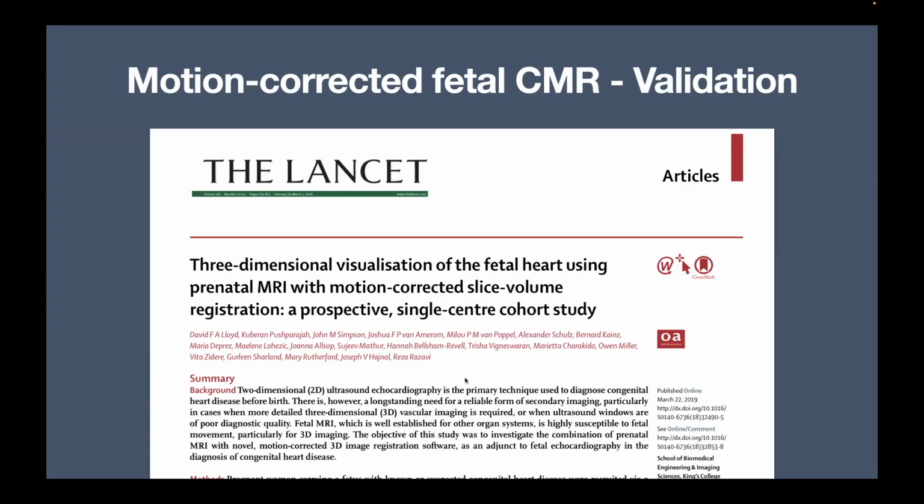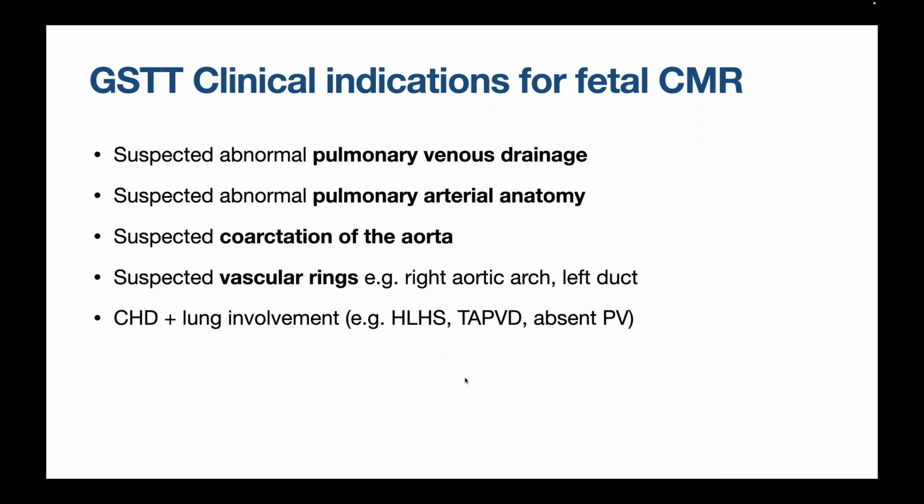So we did some validation work. We published that back in 2019. Lots of validation work with echocardiography, measurements, visualization, and so forth. About 85 patients in that series. And then we approached our trust, our hospital here, and said, we think we can offer this as a clinical service. We're still getting referrals. And this has been our clinical referral template since then.